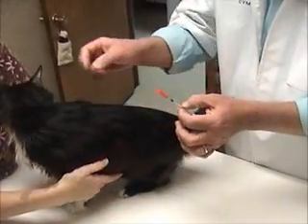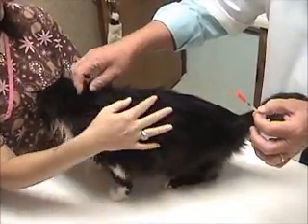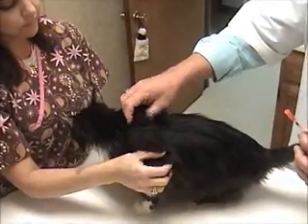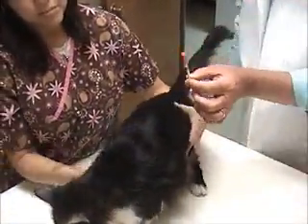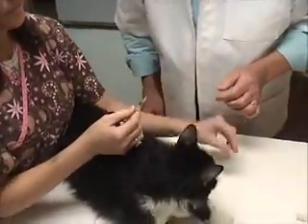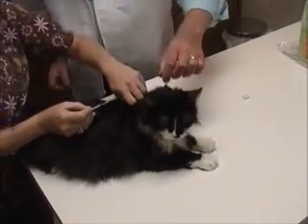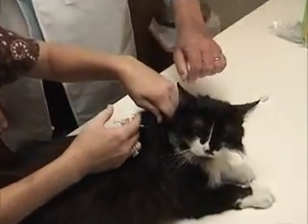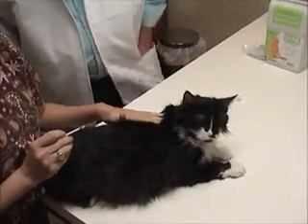What Catherine's going to do is tent up an area of loose skin — of which kitties have a lot of, as do dogs, but cats especially — right in between her shoulder blades right here. Kathy's right-handed, so she's going to use her right hand to direct the syringe and her left hand to pull up the skin. She's going to make a little tent there. Sweetie's real cool about this. She just puts it in there, injects it, takes it out, and rubs it in a little bit.